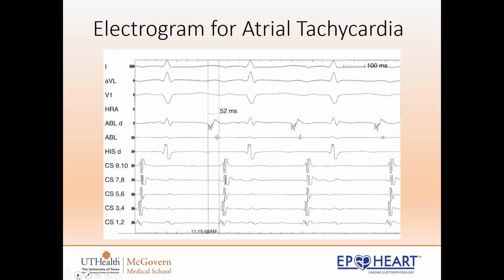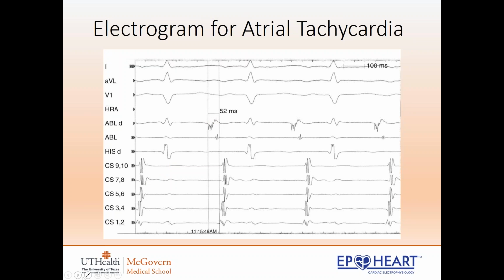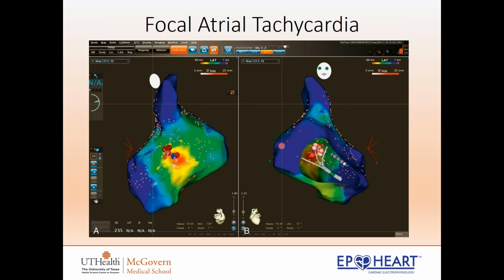So we take that information and we build this map. And this here is where a lot of people with our degrees come into the medical device industry, so to speak. They are the ones who are running these 3D mapping systems for companies out there like Boston Scientific, Biosense Webster, and Abbott or St. Jude's. So we take the signals from inside the heart, these intracardiacs, take points, and we create these maps.